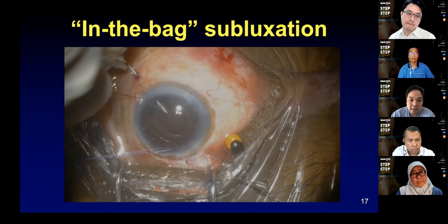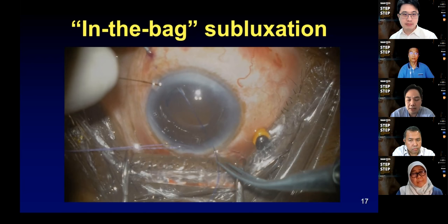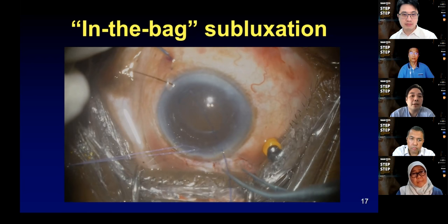Once I've come through, I will feed in this 6-0 Prolene or 5-0 Prolene, whichever you have, both are available, and feed it into the 27 gauge needle. It's relatively easier to handle because it's stiffer and thicker, not like your 9 or 10-0 Prolene. And then you just pull it through that way.